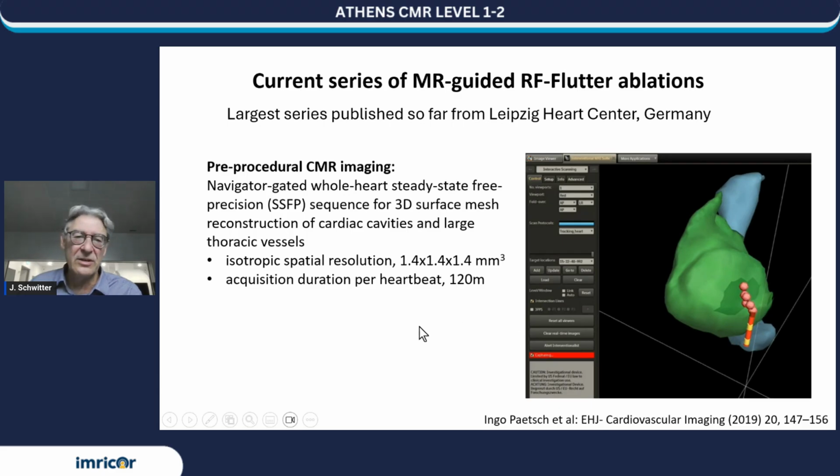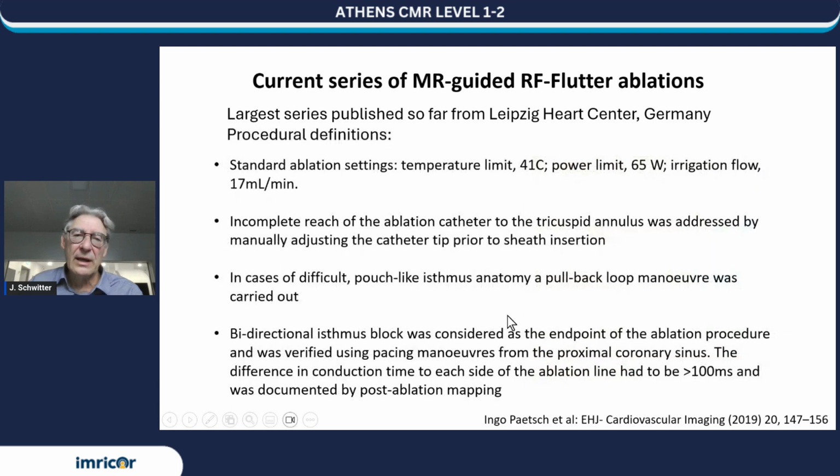You see the catheter, and you typically acquire these data before you start the intervention. We do that usually a week or so before, so we can work on that to see what we have, and then we just align it before the intervention. And this is now this quite large study. So the procedural definitions were as follows.